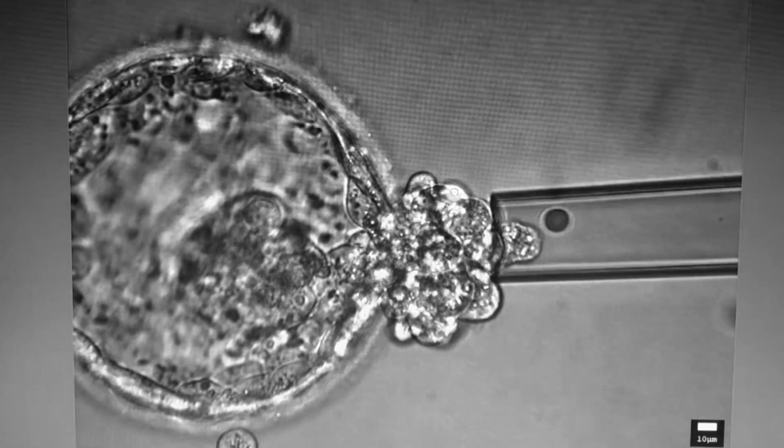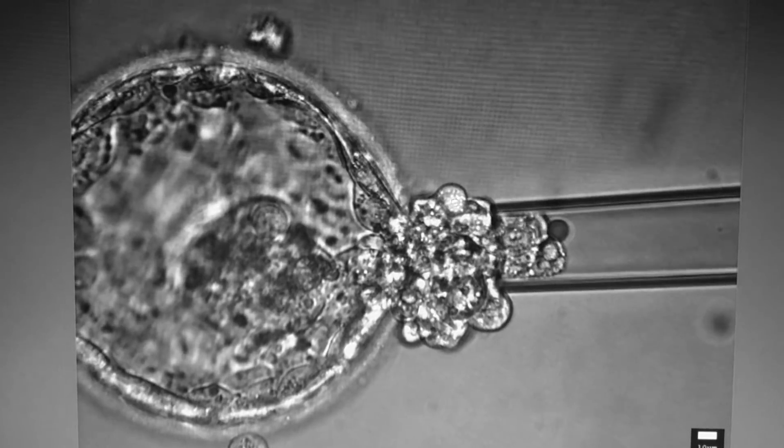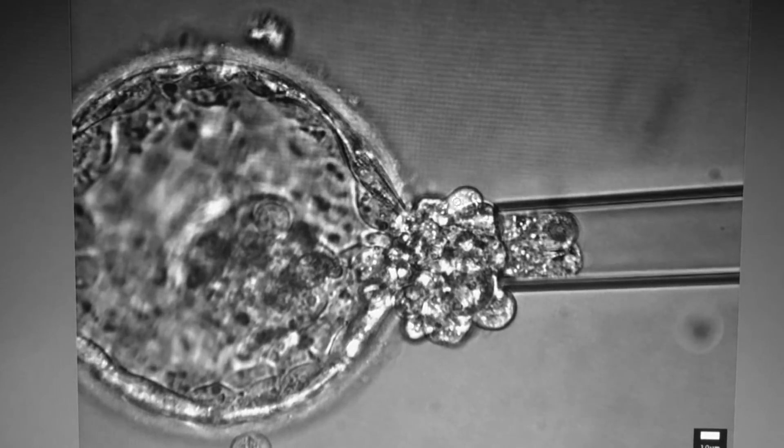PGS or pre-implantation genetic screening is one of the most fantastic techniques in order to assess the chromosomal integrity and status of these embryos.